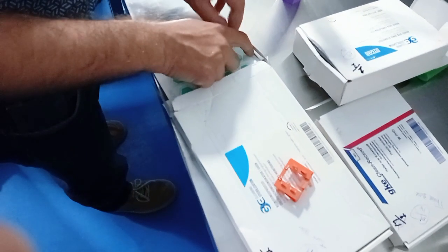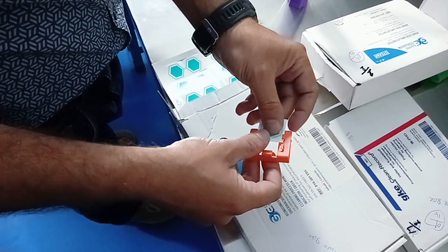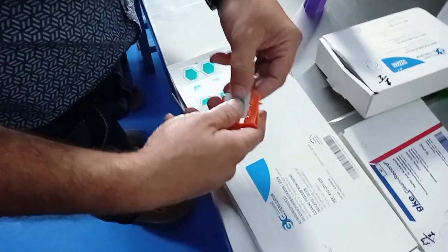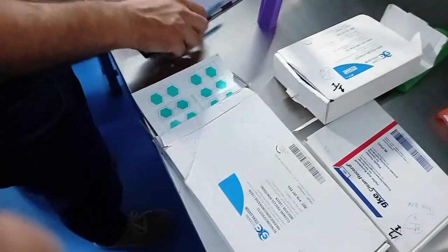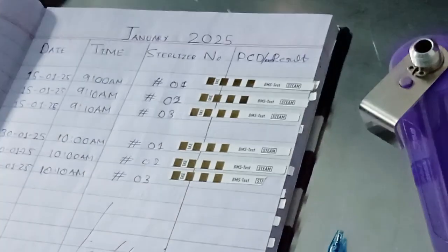This green color strip is a chemical indicator that is added in TOSI. TOSI is test object surgical instruments in washer disinfector to ensure the process of disinfection. Next one is Steri-Gage, a chemical indicator that turns its green color into black after sterilization.